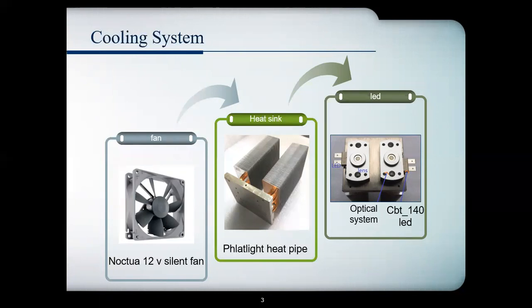The fan is silent because of the presence of a magnet under the rotors, and thus the magnetic field is applied equally on both directions of the fan, providing more self-stabilization of the rotors and thus having a silent fan. This is also the SSO bearing.